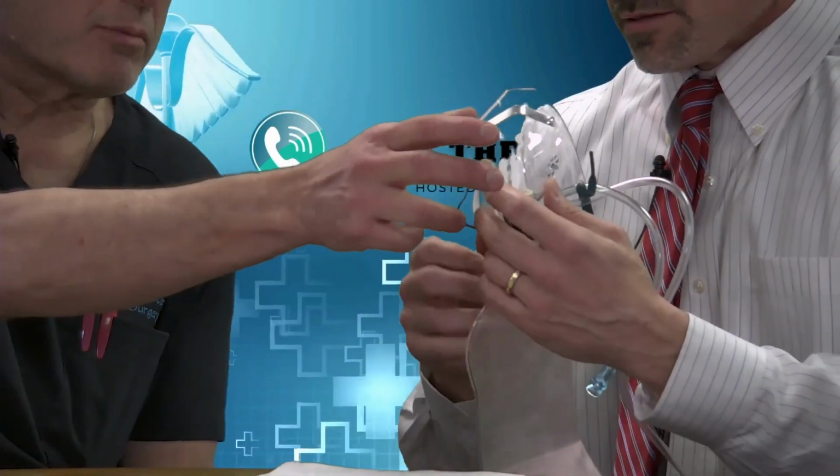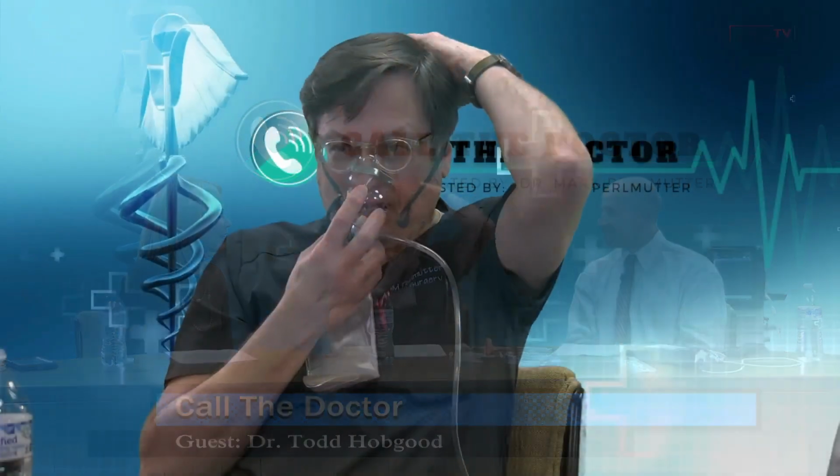We do this because... Show them on me, that'll shut me up. There you go. That'll make it look better. Zoom in on this. That looks like a CPAP kind of almost device. So it has a rubber band that looks like a face mask. And so the patient doesn't have to do anything. Then this tube. They sound better already, don't they? Yeah, you do.